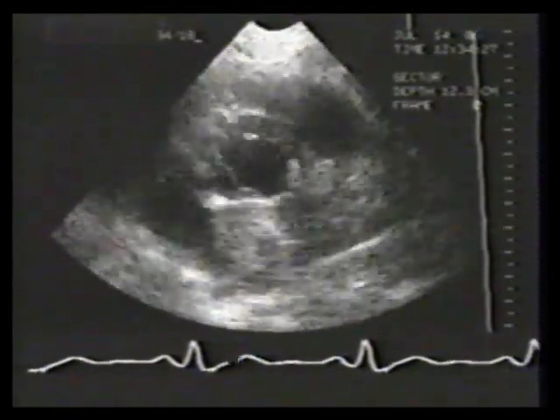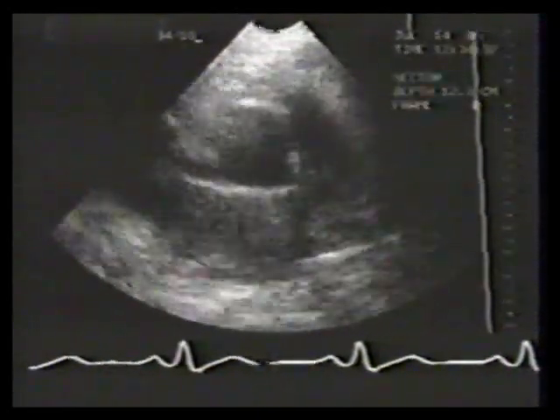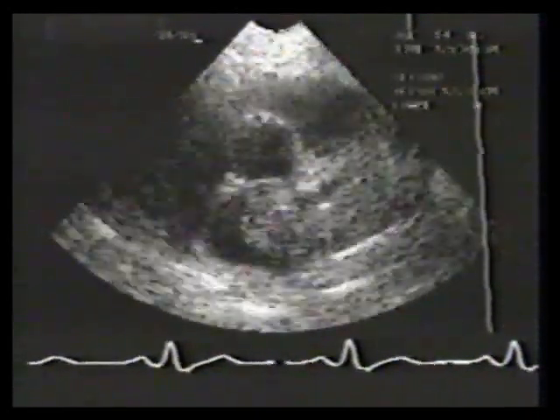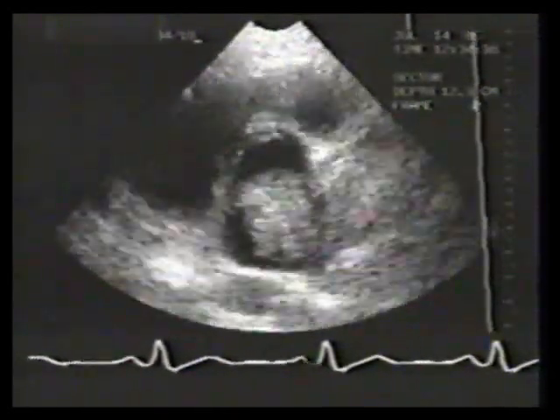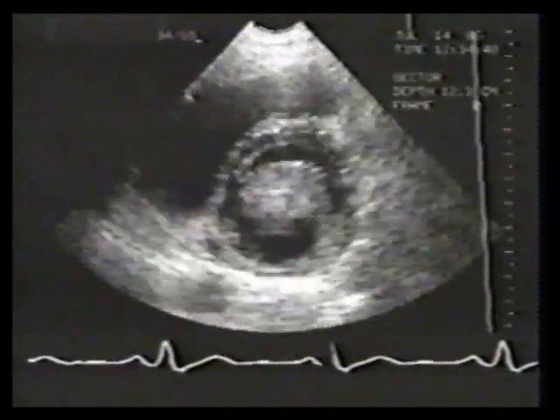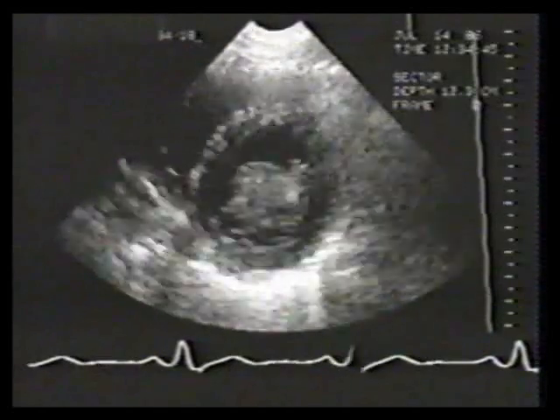Note as the scan is carried back down through the atrial cavity that it distinctly arises from a lower lobe pulmonary vein that is not attached to the atrial septum. One should always be wary of masses not attaching in a typical manner characteristic of atrial myxoma.